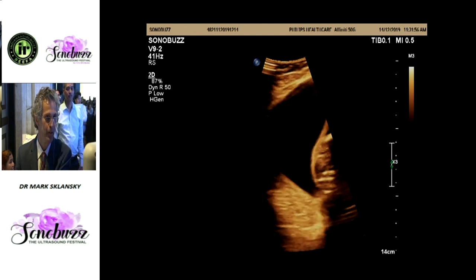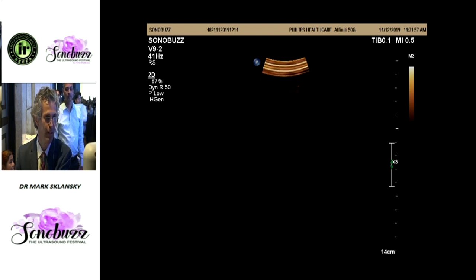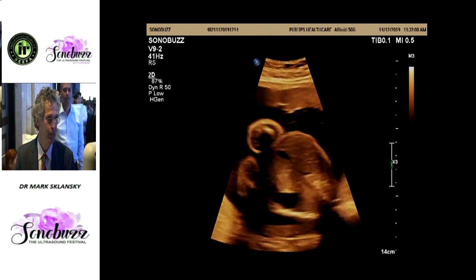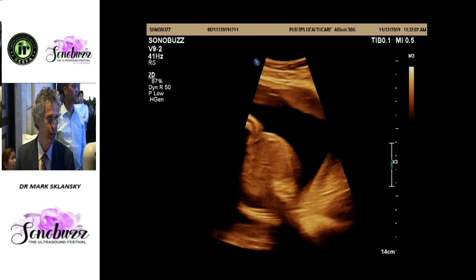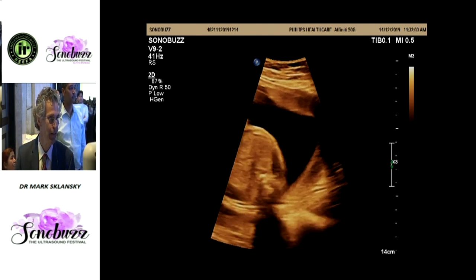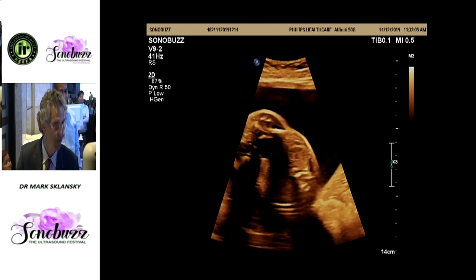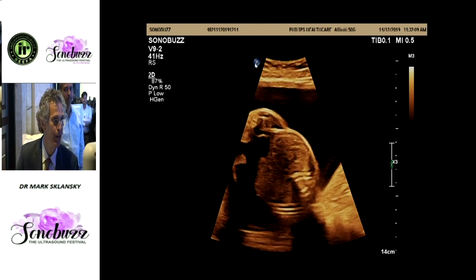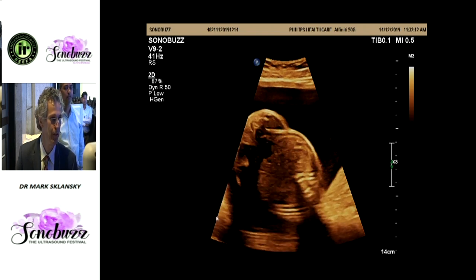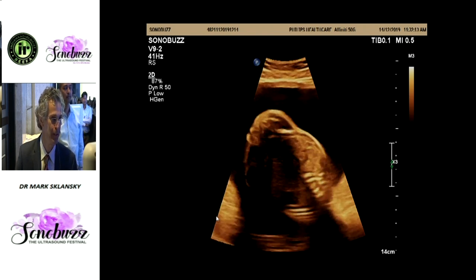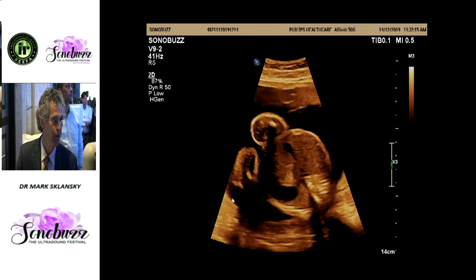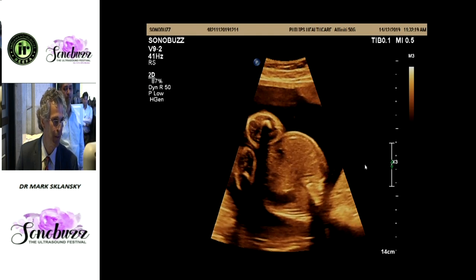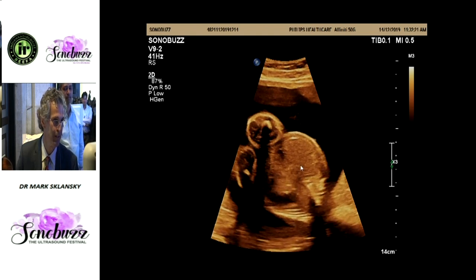The screen was moving the wrong way, so I'm going to turn the probe around. Now I angle to the maternal right and to the maternal left, and now I know I'm holding the probe correctly. I don't bother looking at the marker on the probe — I just want to see how the baby's lying. Now we know this is the mother's right and mother's left, and we need to figure out fetal left and right.